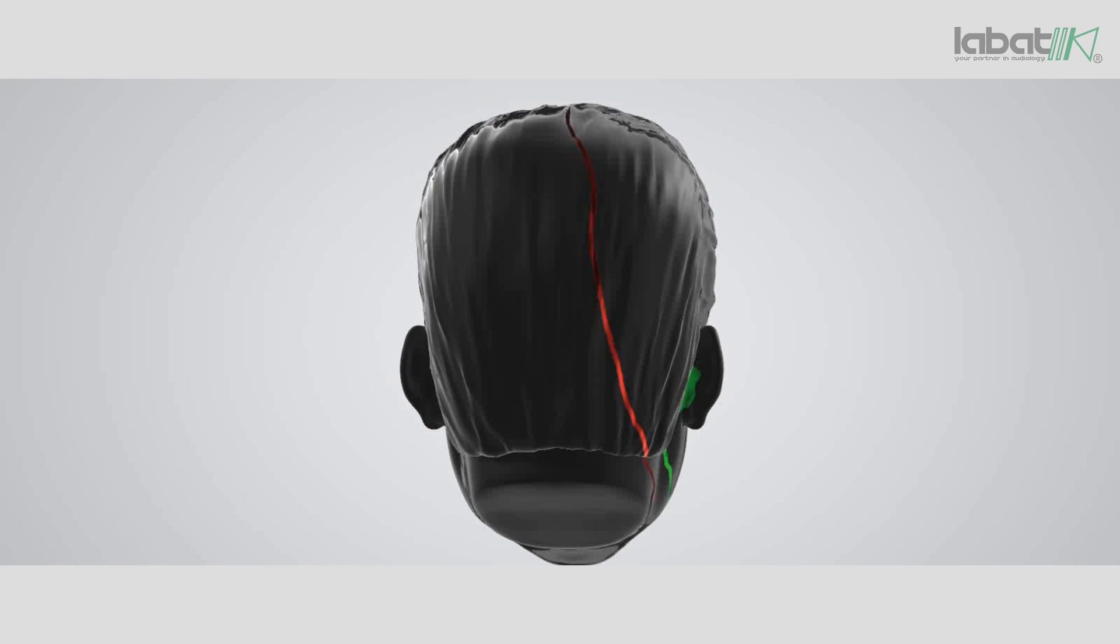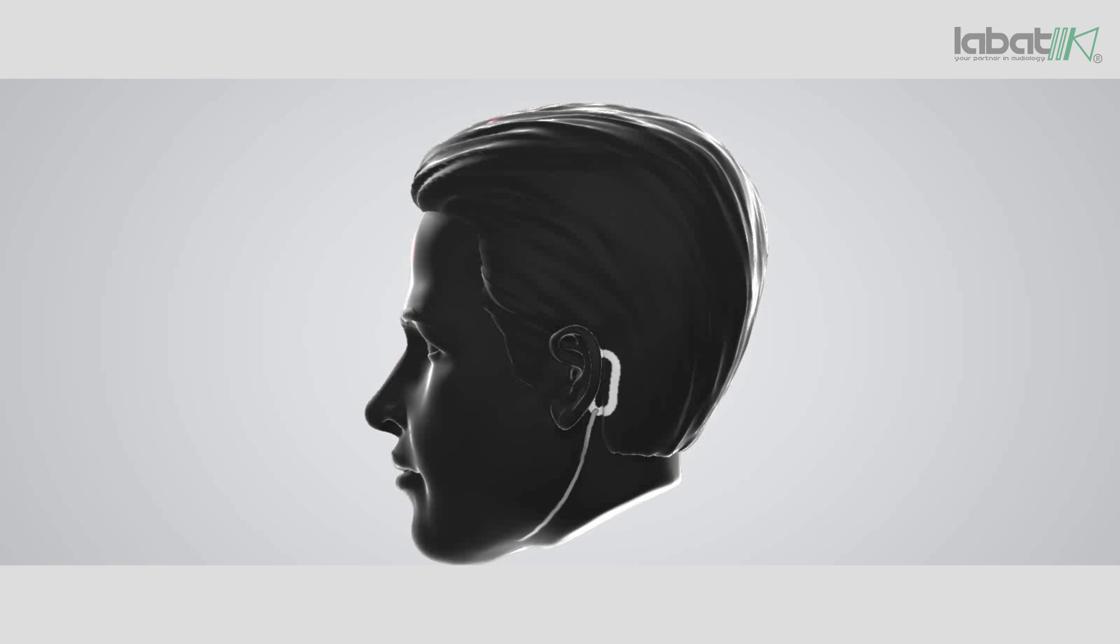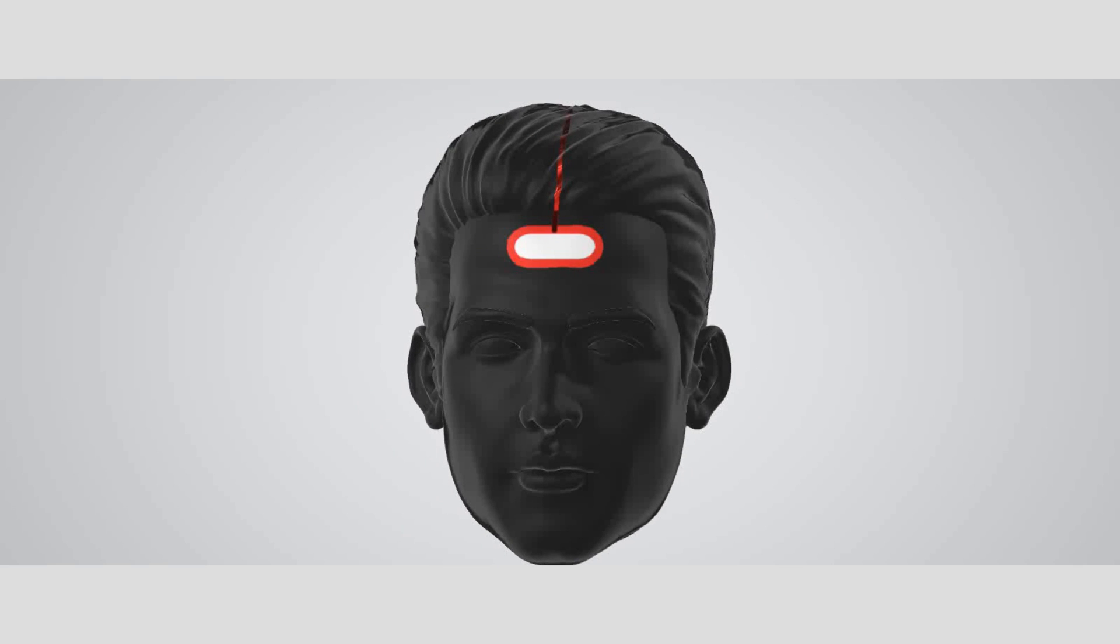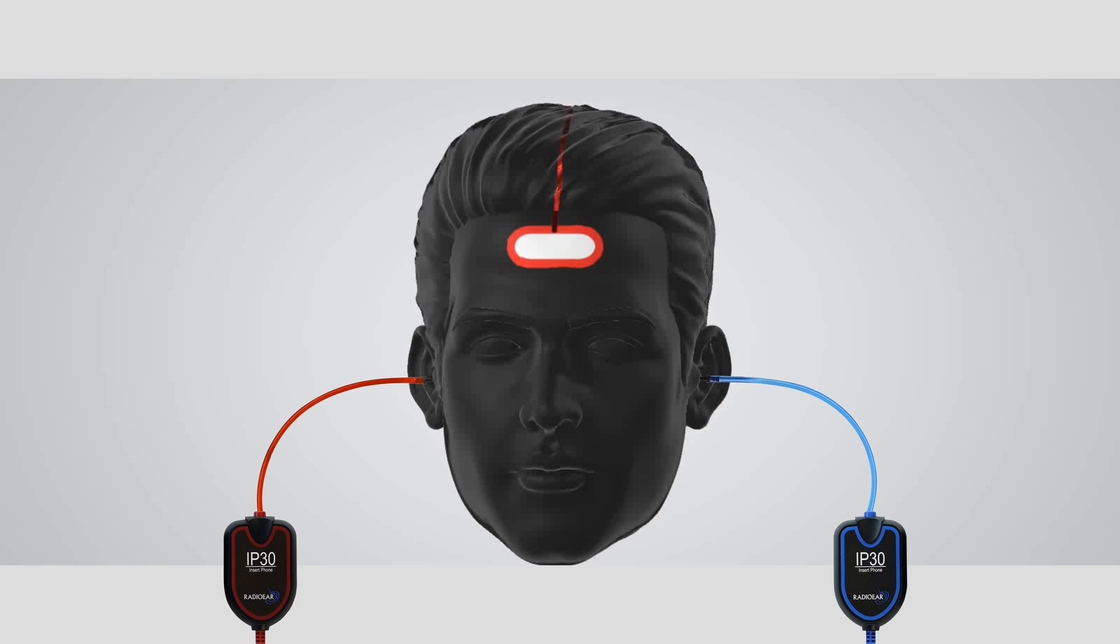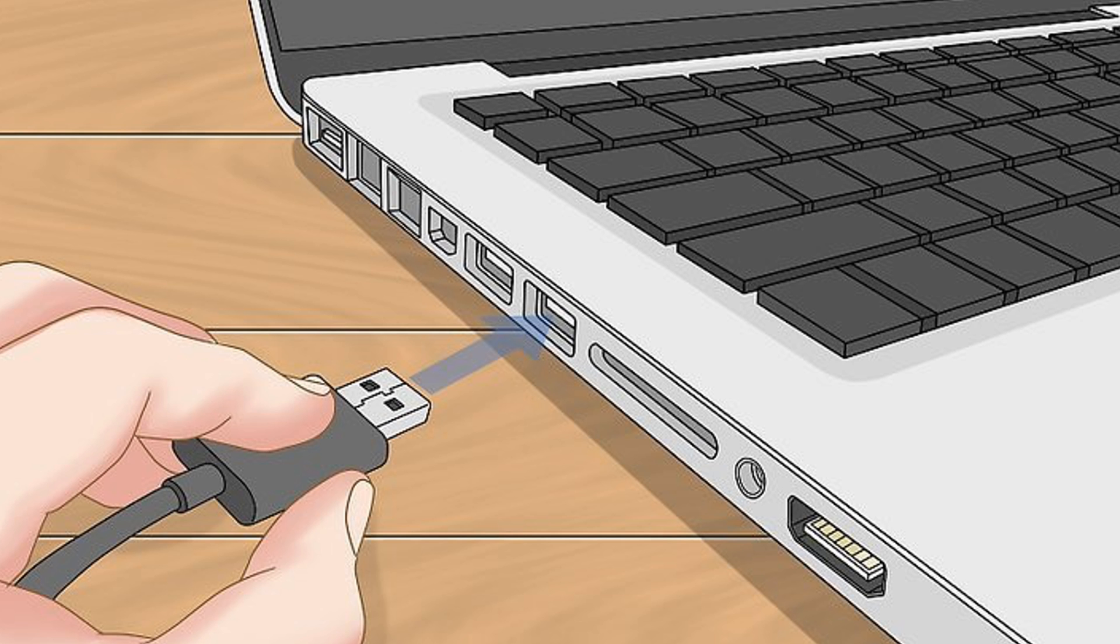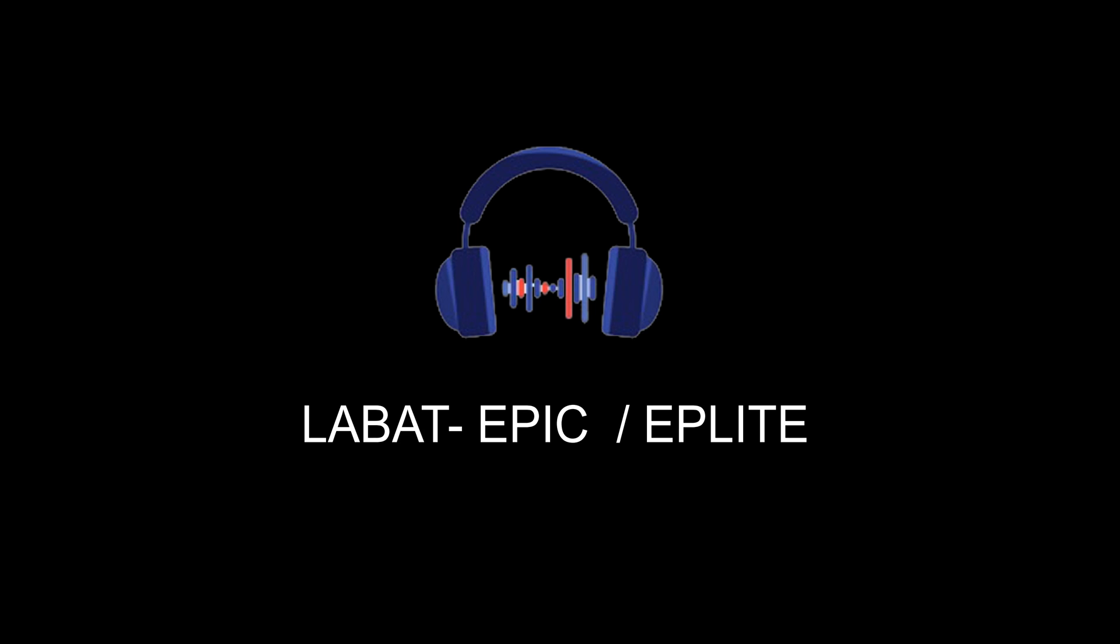Make sure all the electrode placements are properly done. Now connect your inserts properly. Connect your device with the help of USB cable. Click on our shortcut icon.